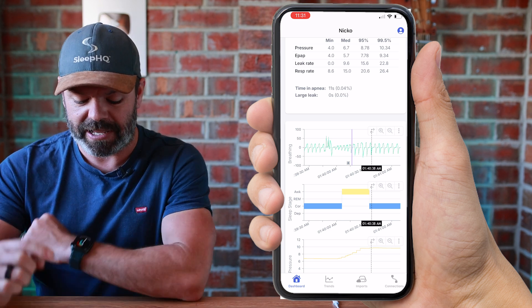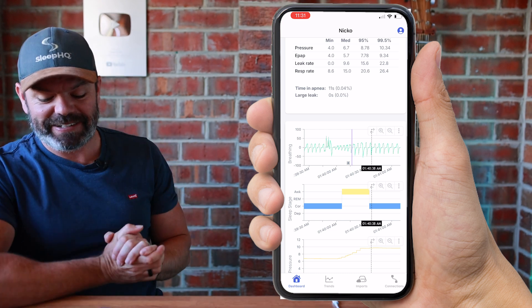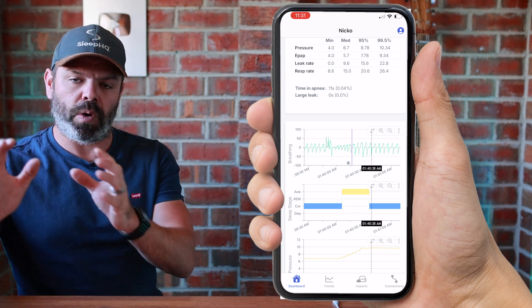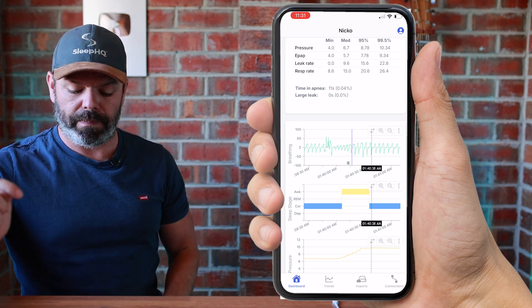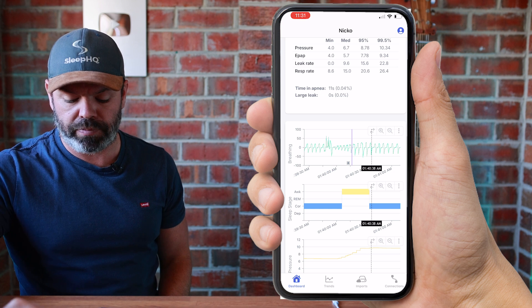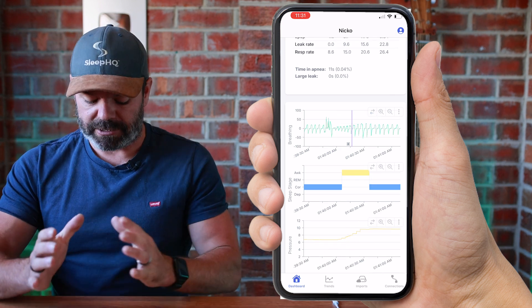We've got the sleep stage data coming in from the Apple Watch - we've got core sleep, and look at that, we've got this yellow bar which is 'Awake'. So hypopnea, wake up out of sleep - boom, there we go! And we can also see the pressure increasing there as well.